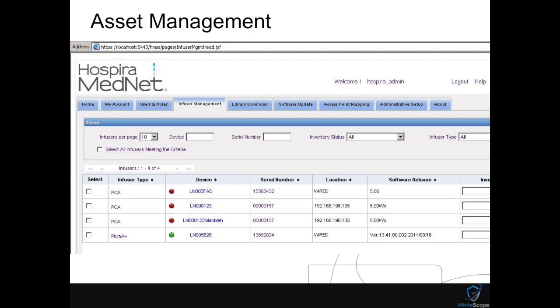The software itself will receive these pings from the devices and update this chart here. I have this software, I've been running it in my own personal lab, and this is what it looks like. There is no validation as far as what's coming through, so you can name your device whatever. This software really has no way of knowing that a real device is talking to it. It only knows that it received the right HTTP request, and it's going to populate that device data inside the user interface and the database.